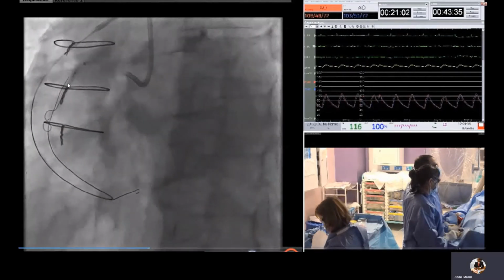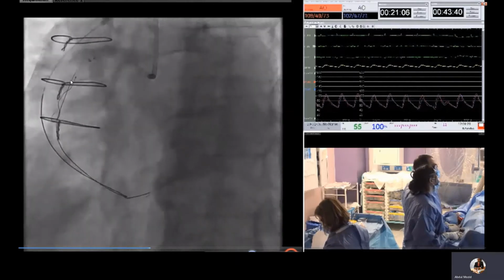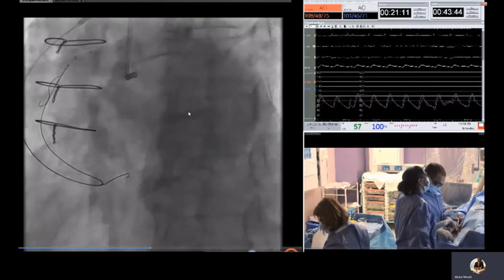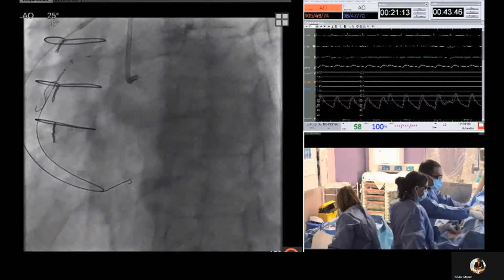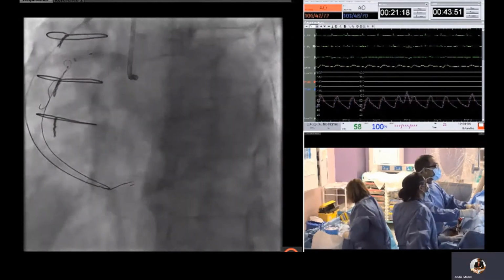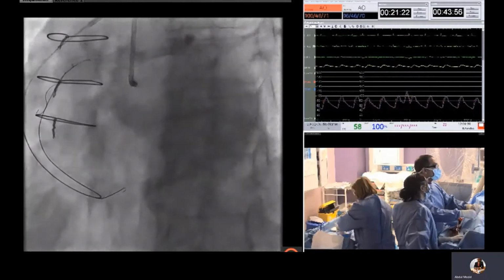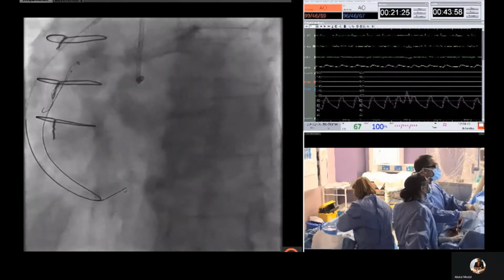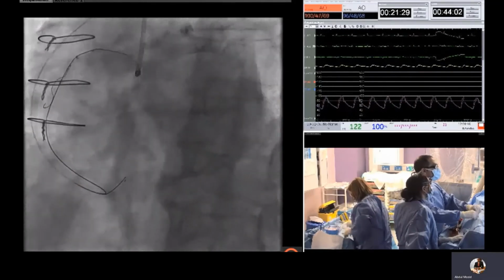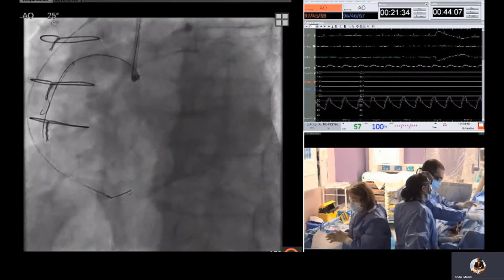And it should be very easy then to perform your reverse CART. And in fact, after that, you can see that the wire is very well aligned now. So the balloon is removed. And then attempted to wire the guide extension, which is relatively easy. The guide extension is then wired with a Retrograde Pilot 200.